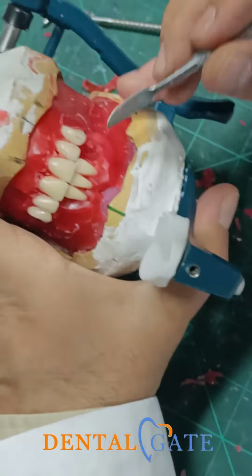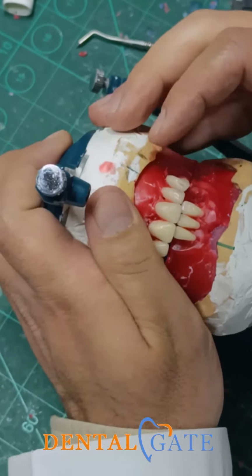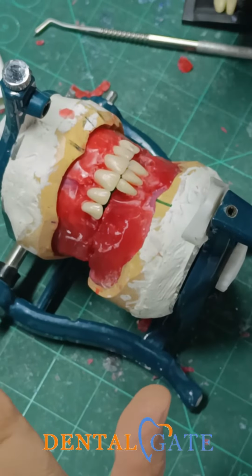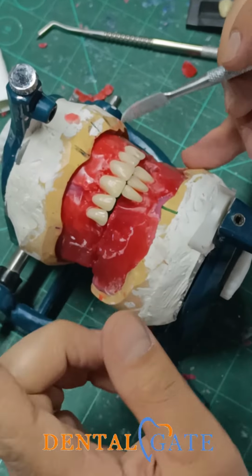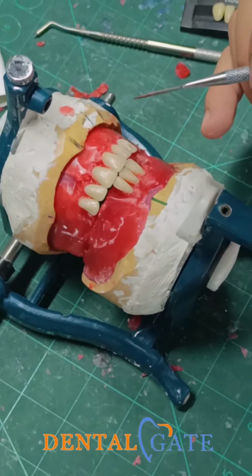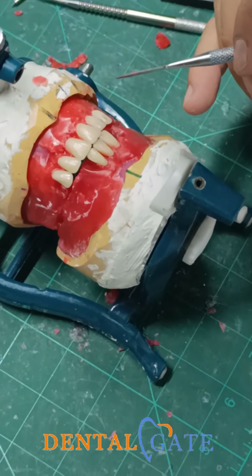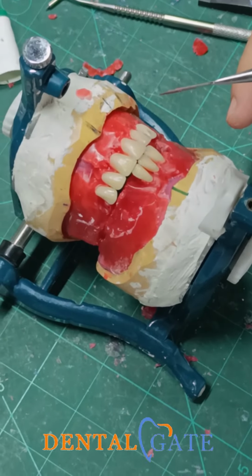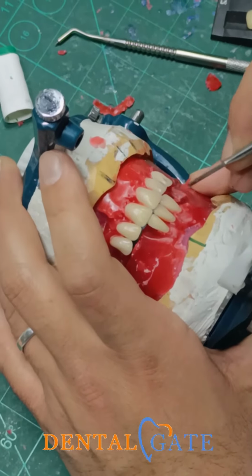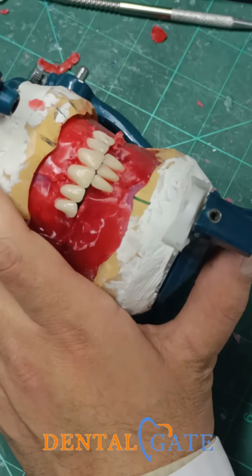So I need now to put the canine. It's my mistake. Yes, I must preserve all criteria of the corner of the mouth. It should be included with the two teeth. It should make the canine relationship. It will represent the class 1 criteria regarding the normal occlusion. Okay? This is the main objective of the orthodontist, to make the canine relationship. So the canine, you have freedom to perform all the criteria, regardless of the position.